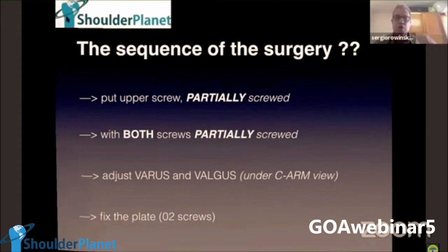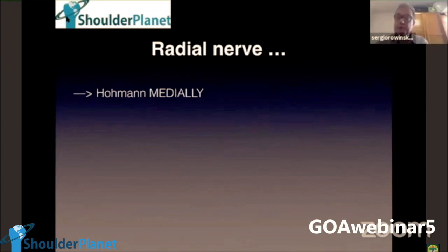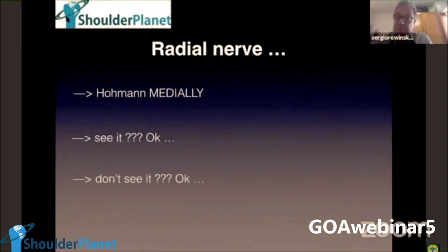So what about the radial nerve? The thing is, you will always have a Hohmann medially, okay? Always under traction. And the thing is, do I want to see it? Yes, but sometimes I find it and sometimes I don't. And it doesn't matter, because pay attention to the rule: a nerve that you don't see is a nerve that doesn't exist. I'm gonna say it again. A nerve you don't see is a nerve that doesn't exist.